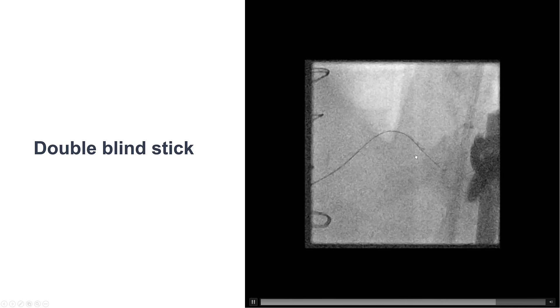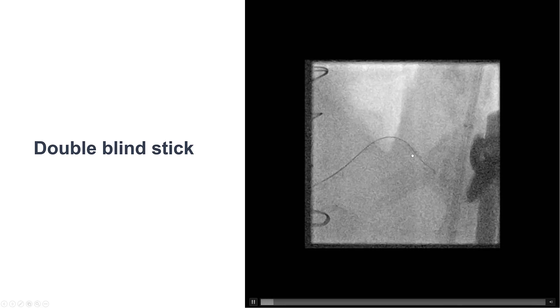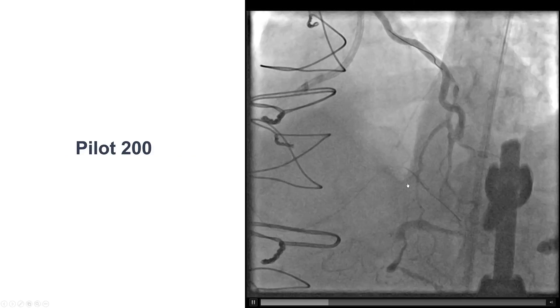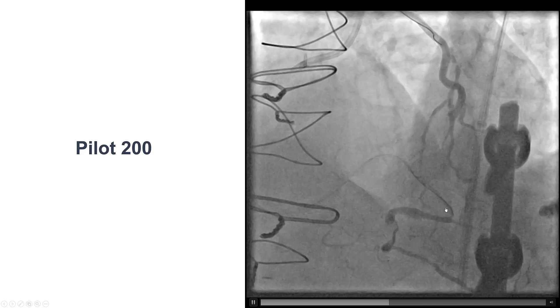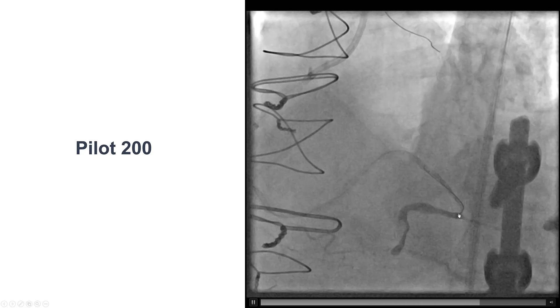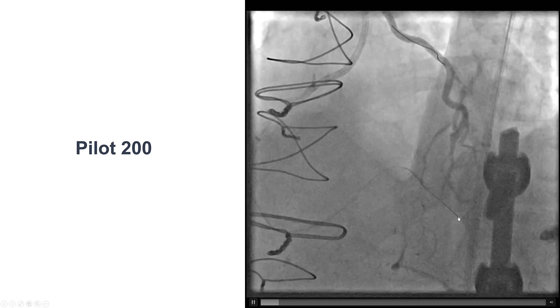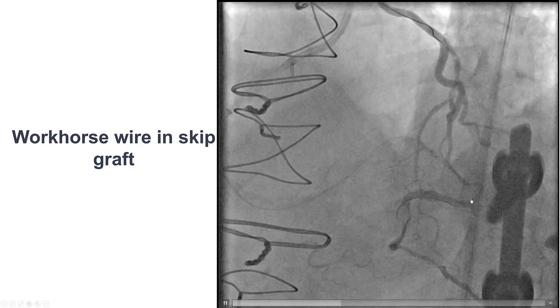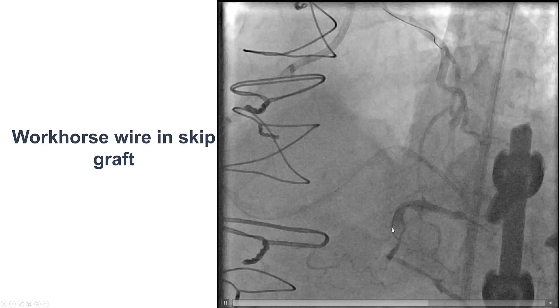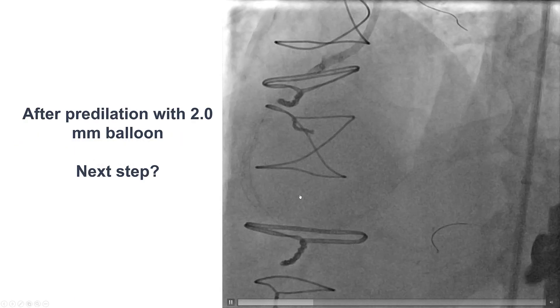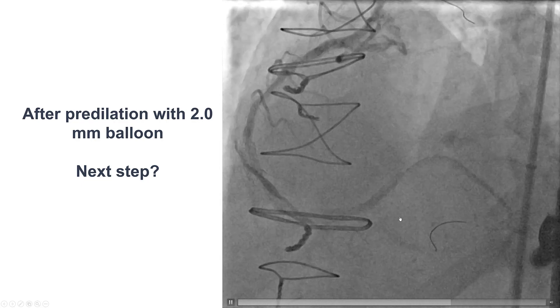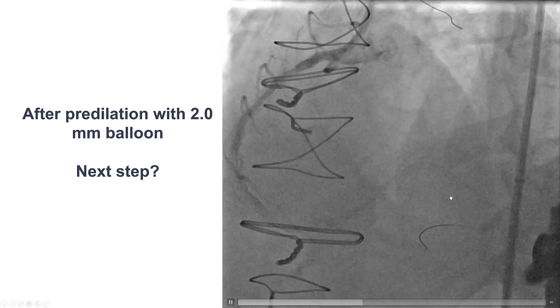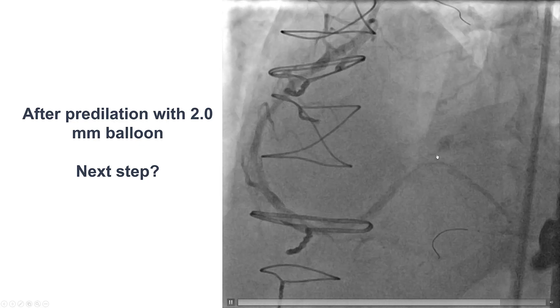We did the double blind stick and swap: we stuck proximal to the proximal marker and then performed the exit between the two markers. We advanced a Pilot 200 that seemed to course along the vessel, although it had some difficulty going through the distal segment of the anastomosis of the skip graft. We advanced a microcatheter and then used a workhorse wire that nicely advanced into the skip segment of the saphenous vein graft. We predilated the entire RCA with a 2.0 millimeter balloon — and then we saw what was not unexpected, given exit of a microcatheter and wire into the segment.